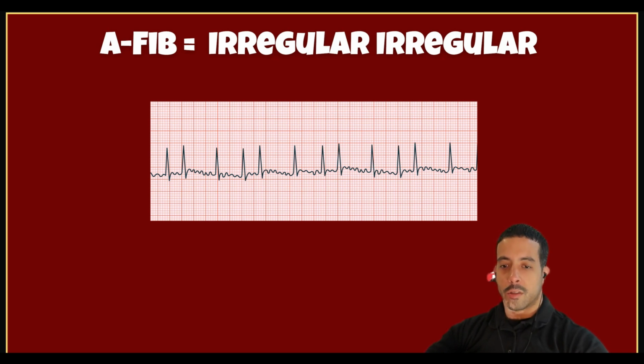Now, there are people that have AFib and they walk around with AFib and they're taking medications at home, amiodarone and all these other medications, and you may not need to treat them. So remember, treat the patient, not the monitor. If you see an AFib with a heart rate of 145, you may not need to treat them. But if you see an AFib at a heart rate of 170 and they're symptomatic, then we're going to go ahead and give them medications, and take it from there. But remember, treat the patient, not the monitor. But definitely use the monitor as a diagnostic tool.